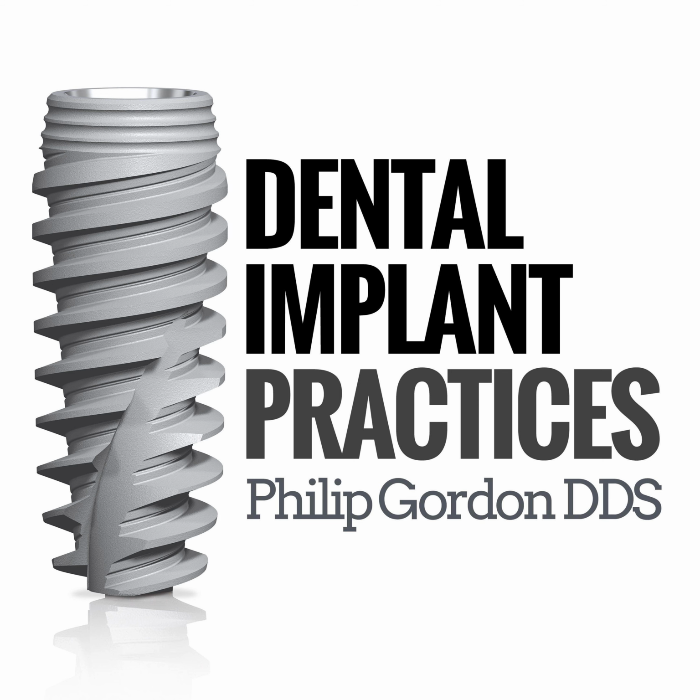All you got to do, unscrew the provisional, screw in the wax try-in, check the bite. Do they like the aesthetics? If that all checks out, get us a new Blue Moose bite because we always like new stuff. Do a light body VPS in between the tissue and the wax try-in. Send all that stuff back to us. Next time the patient comes in is to pick up their final prosthesis.